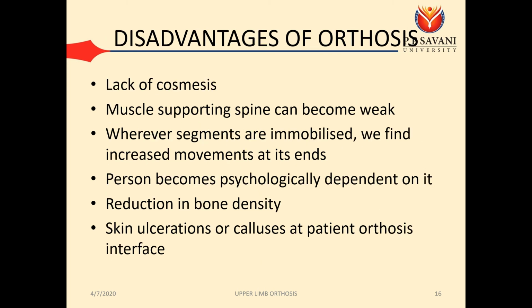Last thing to be discussed today, disadvantages of orthosis. What is the disadvantage? There is lack of cosmesis. Wearing something over your hands, over your lower limbs, over your trunk does not look appealing. That is lack of cosmesis.